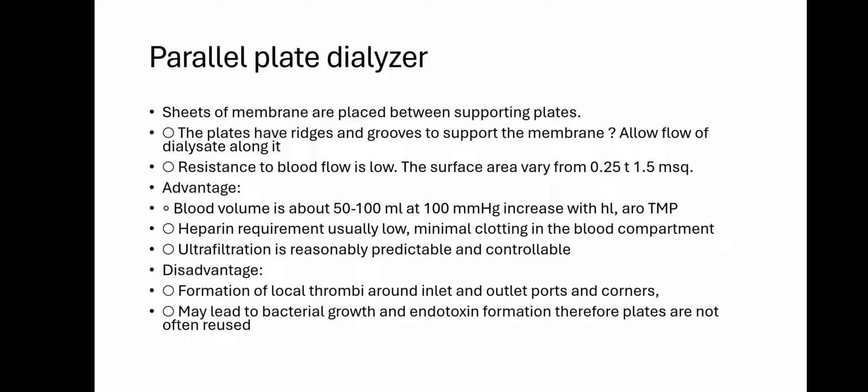The advantages of parallel plate dialyzers: the blood volume is about 50 to 100 ml at 100 mm Hg, which increases with higher transmembrane pressure. The heparin requirement is usually low. There is minimal clotting in the blood compartment, and the ultrafiltration is reasonably predictable and controllable.